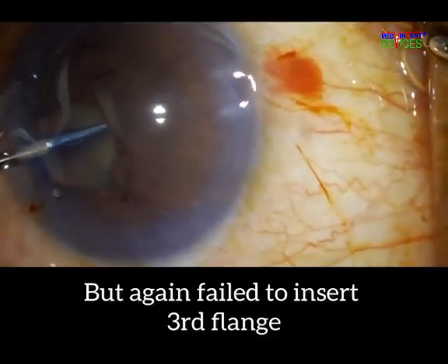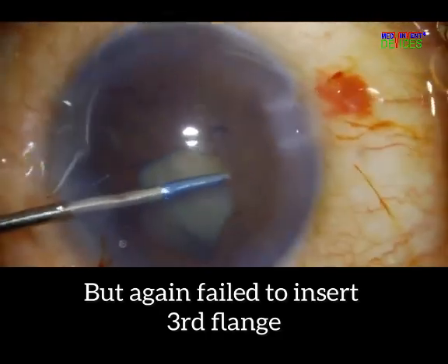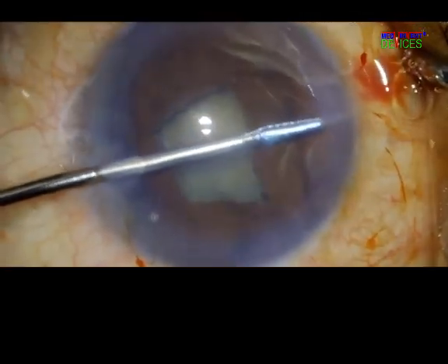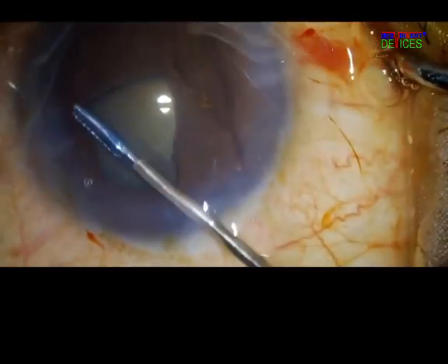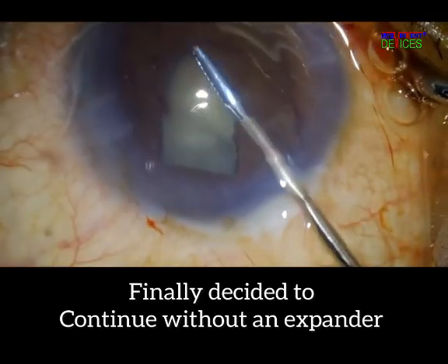Now the third flange is becoming a challenge because there isn't enough pupil margin available. Yet the surgeon makes another brave attempt, and finally he has no choice but to abort.